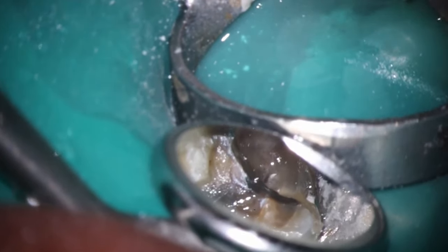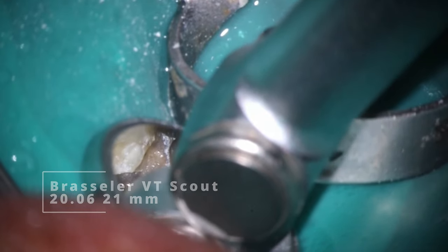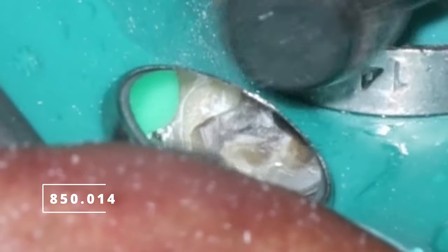It's a little harder to do truss accesses in crowns because you lose a lot of the anatomy, but on natural tooth structure — especially with deep decay on the distal — this is a great way to do it. One tip: you usually want to go more to the mesial than you would think. The reason why is that by the time you open it, most mesial canals curve back towards the distal at the most coronal part, but once you open it up with a 20-06, that curve is gone and it's actually more to the mesial.